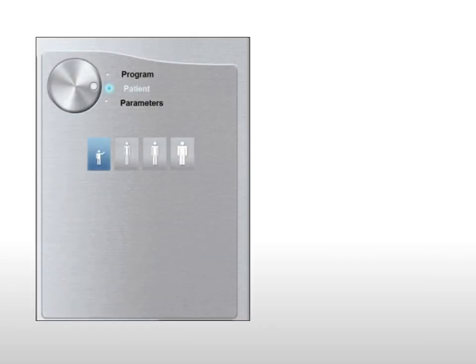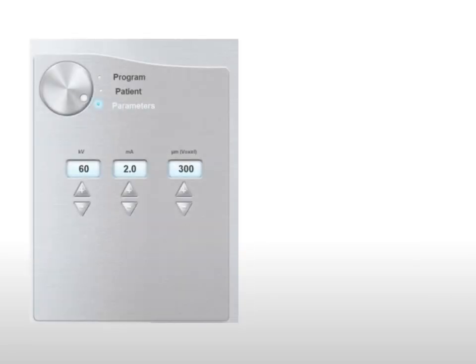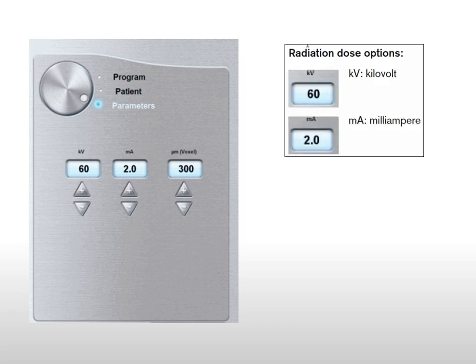Next, click the patient button and select the patient size. Selection of the patient parameter determines image quality and correct positioning of small field of view images. Patient type is based on the age and morphology of the patient. The parameter pane enables you to choose exposure parameters for the radiological image acquisition. If the default parameter setting is inappropriate for your patient type, you can update these settings manually.